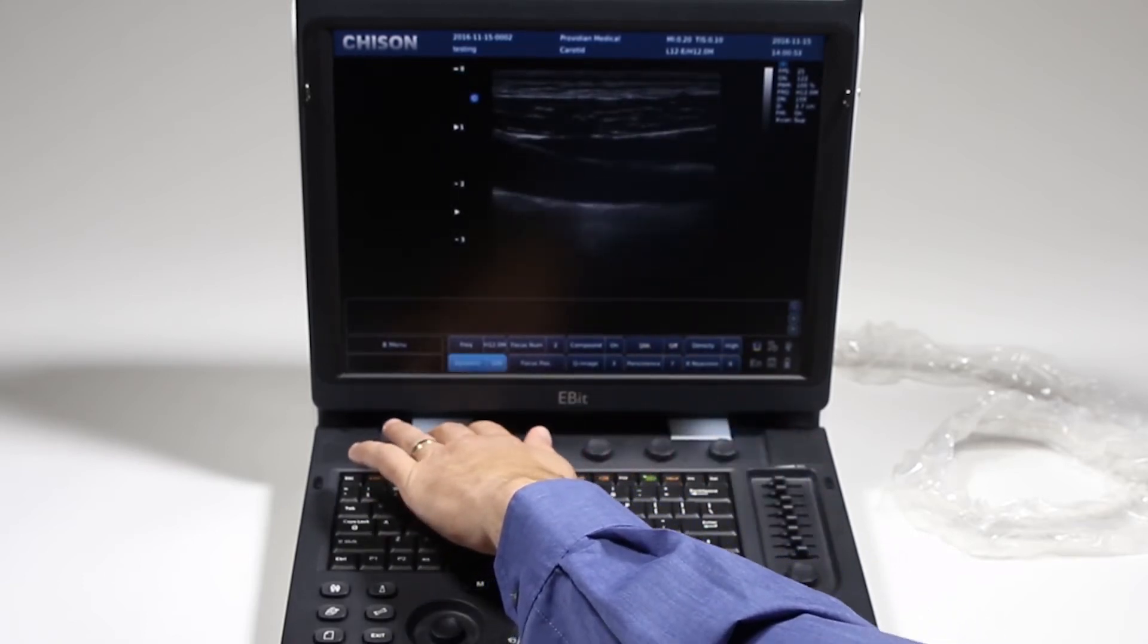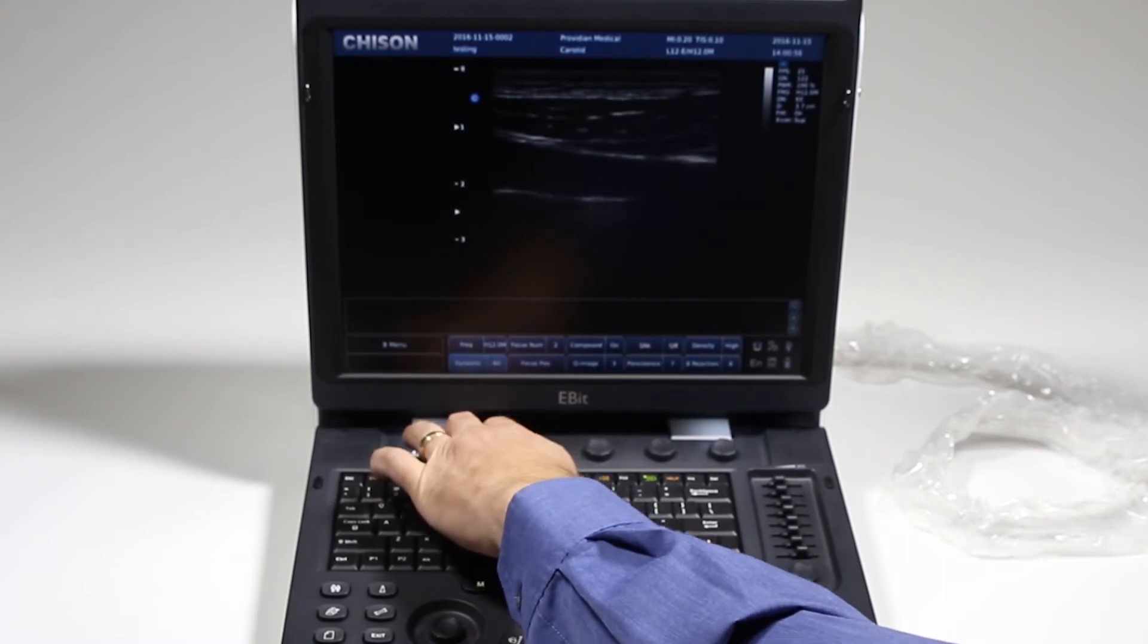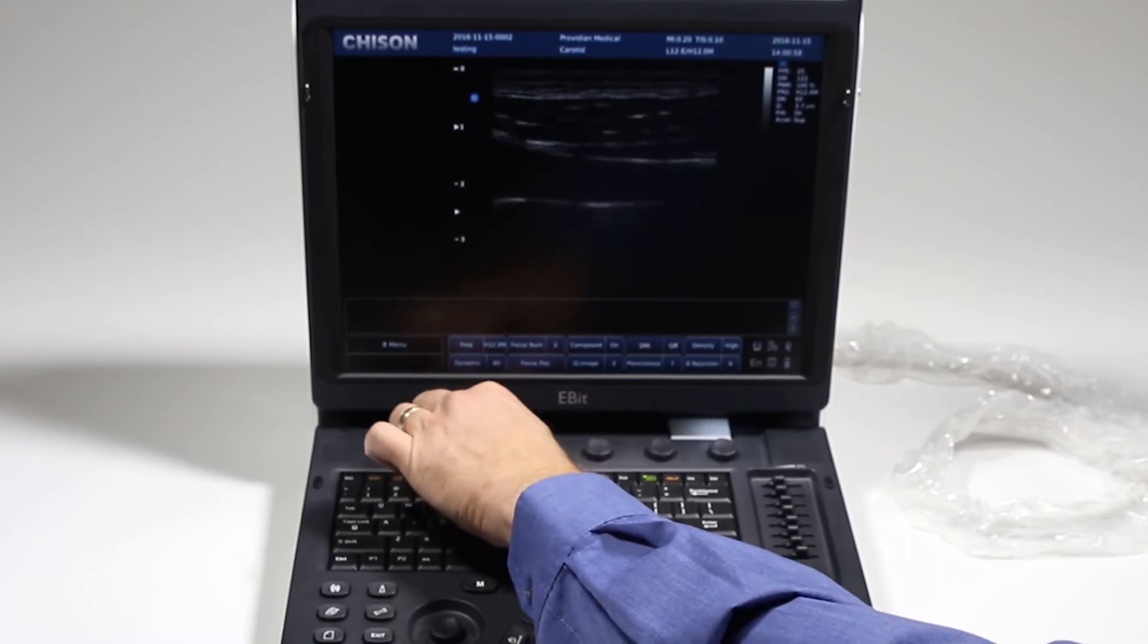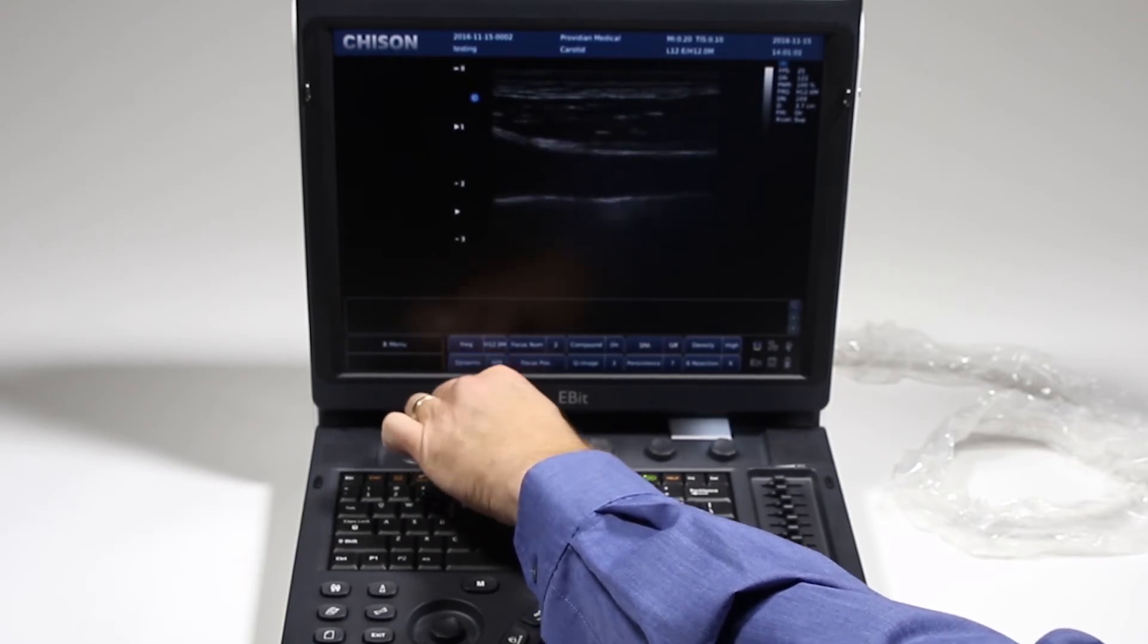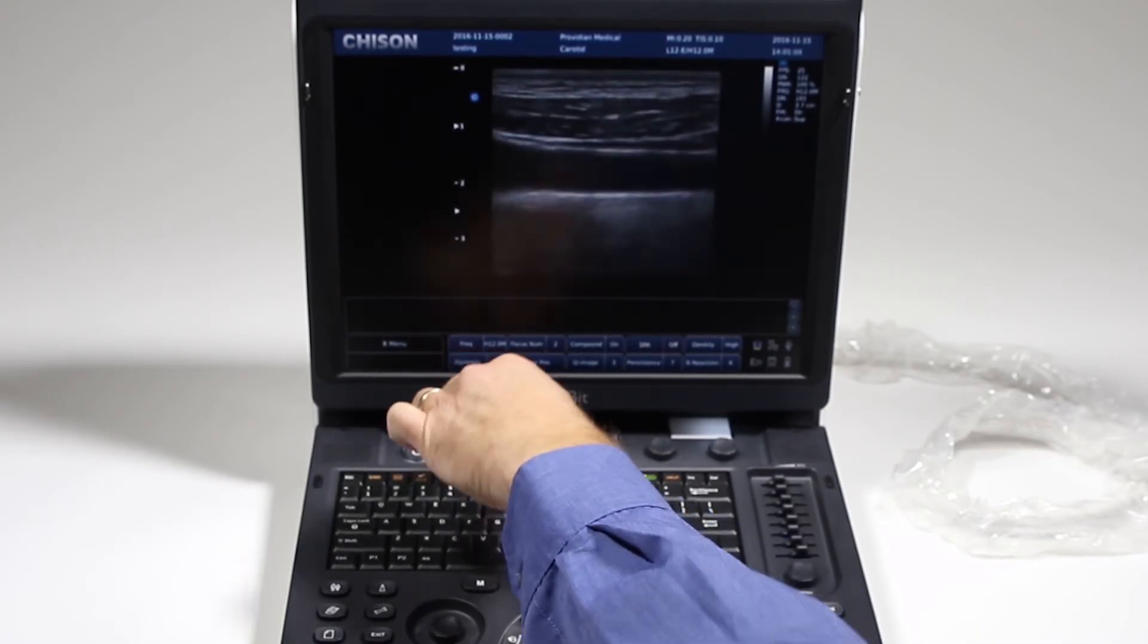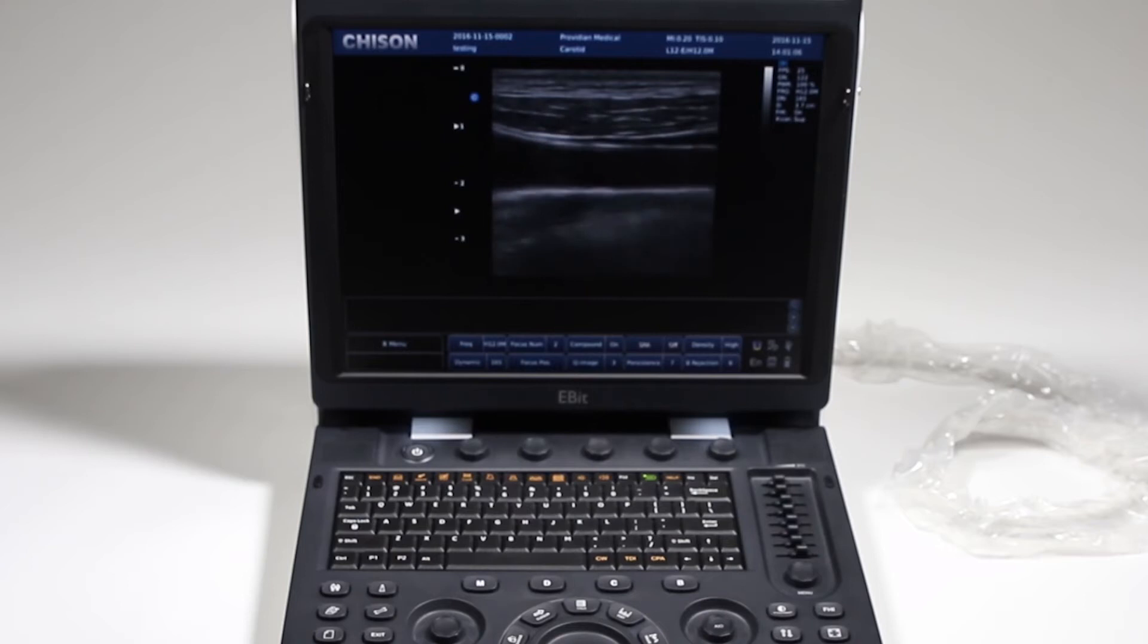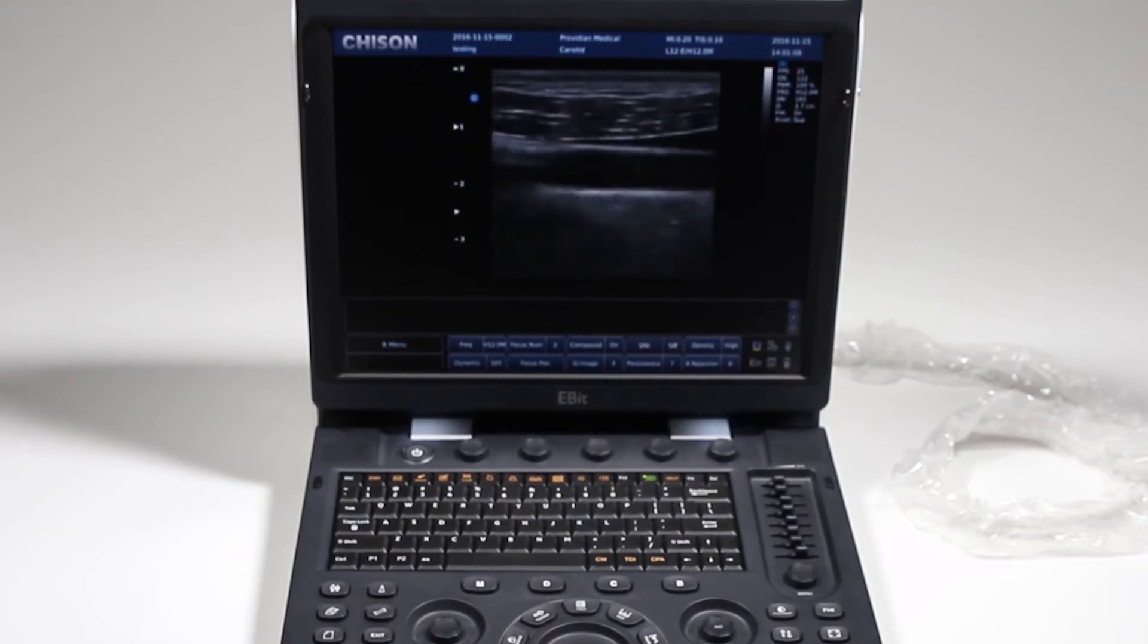Going back to dynamic range, you can see this can have a dramatic effect on the image. As I go down, it's a darker, more high contrast image. As I go up, it's going to show me more shades of gray. So it's a smoother overall image, but your edge enhancement may not be the same.